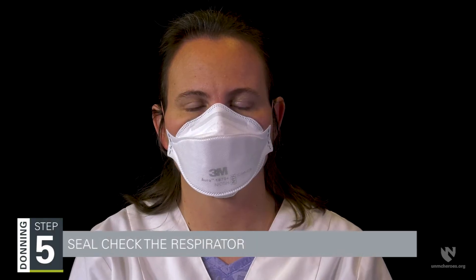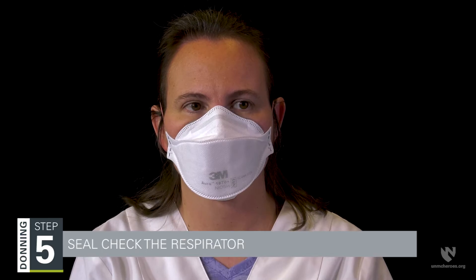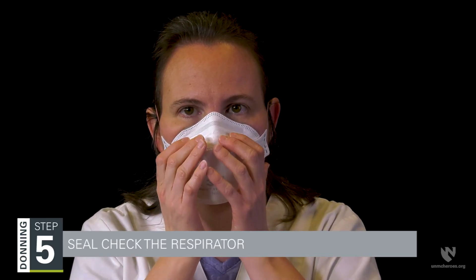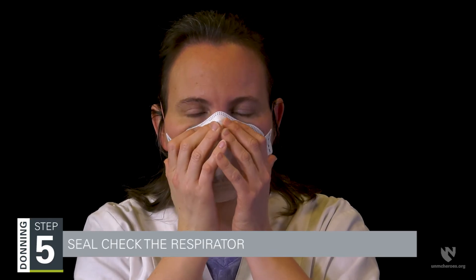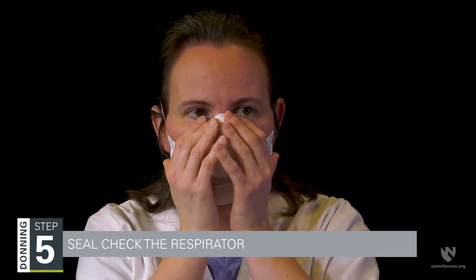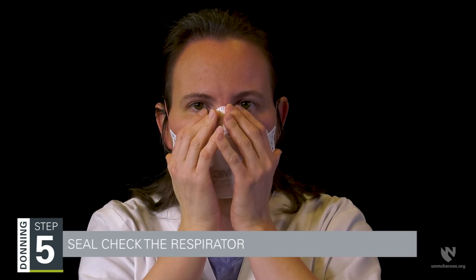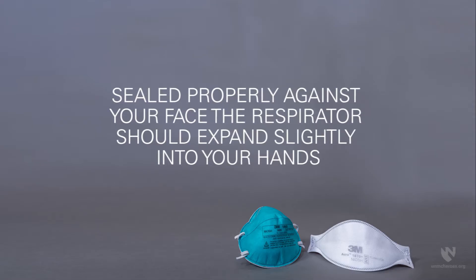Step five is the seal check. To perform the positive pressure seal check, cup your hands over the respirator so that most of the surface of the respirator is covered and your fingertips are around the edges of the respirator. Then exhale into the respirator. If sealed properly against your face, you should feel the respirator expand slightly into your hands.